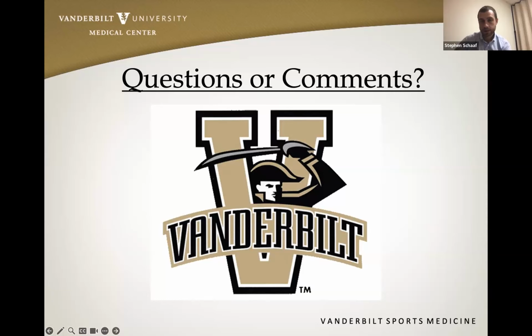I guess, Brennan, I was actually going to ask you, do you have too much experience scanning those kind of capsular ligaments, either the dorsal intercarpal ligament or dorsal radiocarpal ligament? I haven't seen too much literature out there for scanning of those. But I think that is definitely one additional area that ultrasound can probably be pretty helpful, especially as these patients are getting more and more instability.